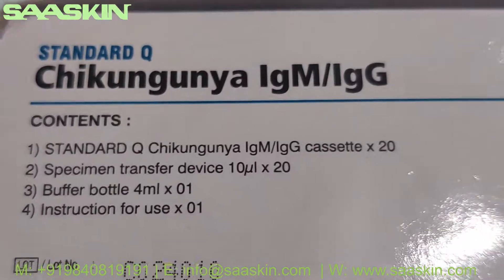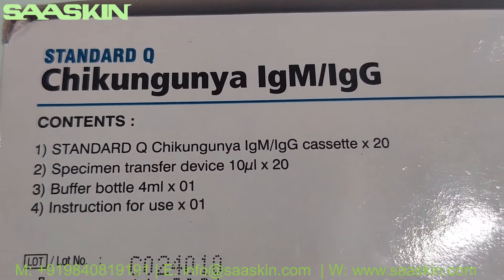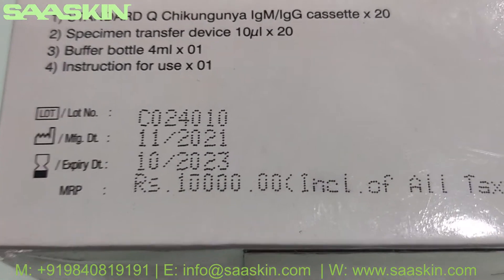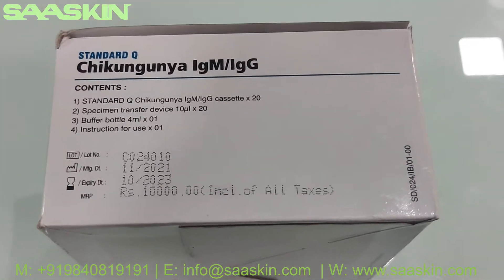Here are the contents: you've got 20 test cassettes, 20 specimen transfer devices, one buffer bottle, and the instruction for use. Typically you have a two-year expiry period.